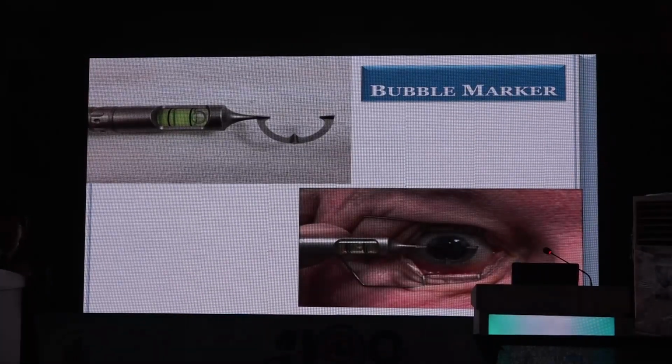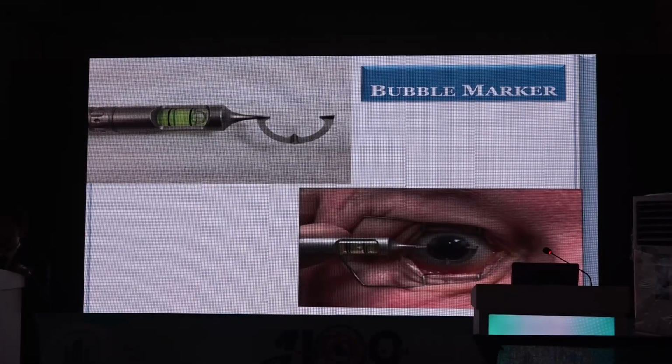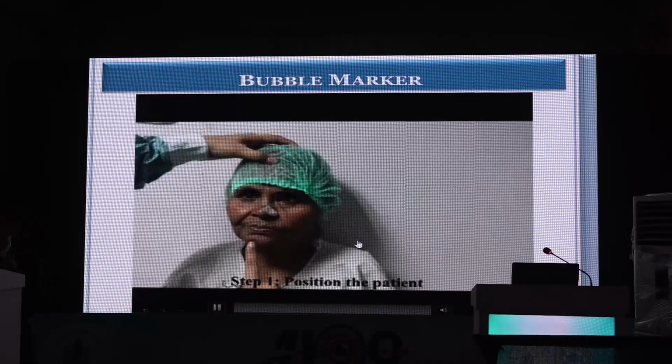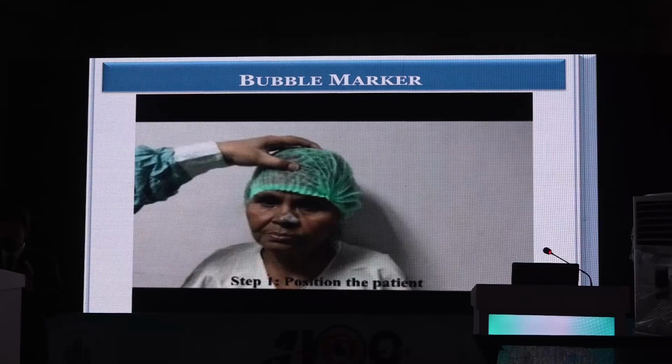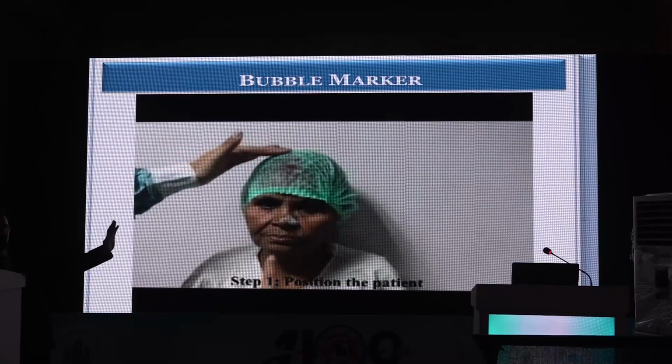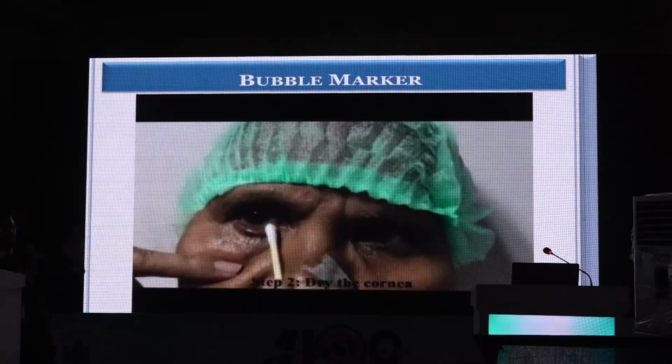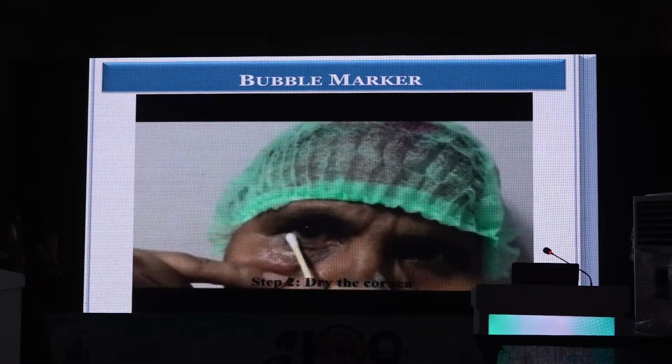The most popular method of marking the cornea is the bubble marker. Here you have a bubble, as you can see. It should be in the center, and then you put some gentian violet over here and then place it over the cornea and mark it. What is essential is that the patient should be upright, standing or sitting. Best thing is that if you have a wall, then you ask the patient to stand opposite the wall, so that you can directly see that there is no head tilt, etc.